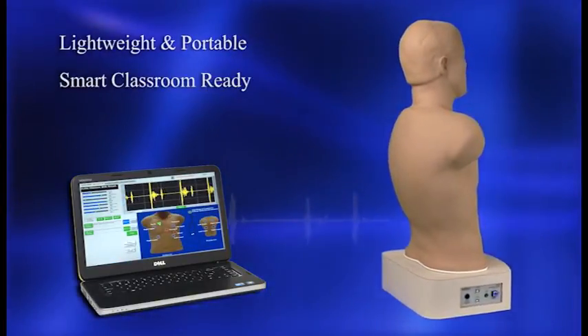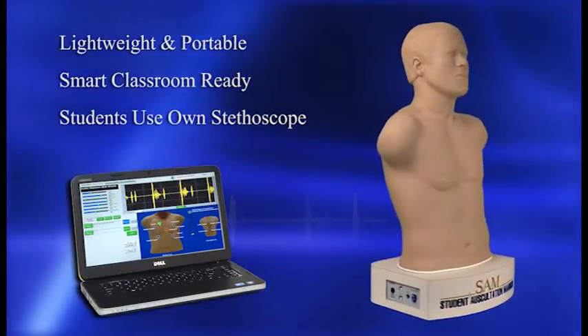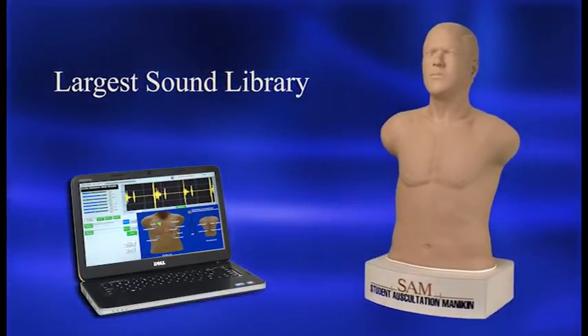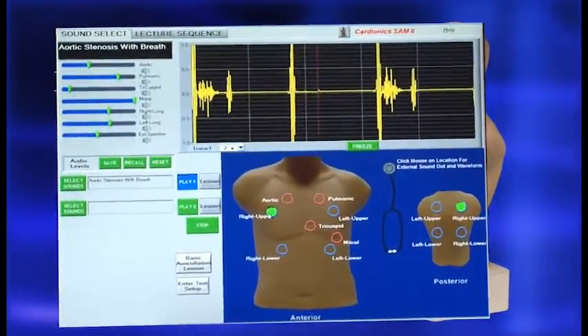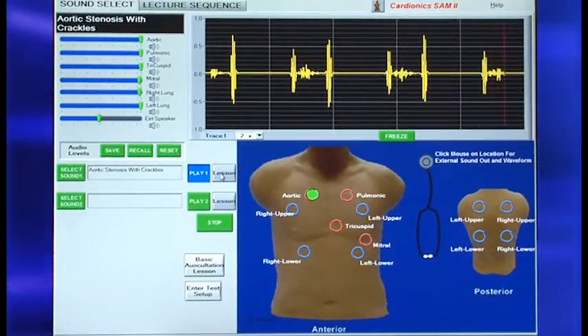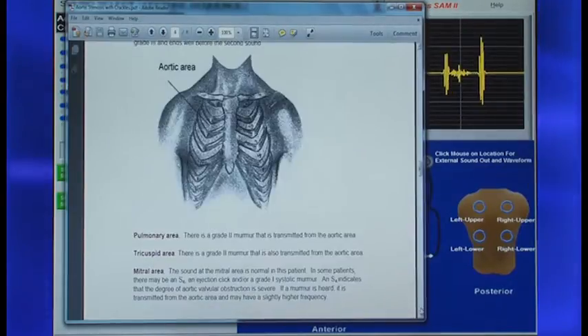Its software interface can be integrated with any smart classroom system, and students can use their own stethoscope. With the largest sound library available in a student mannequin, SAM-2 includes phonocardiograms, sounds displayed at correct anatomical sites, programmable and password-protected lessons, and much more.